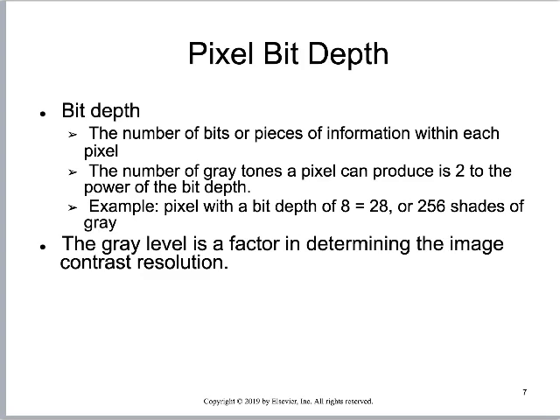Now the way that ties into what we're doing as X-ray techs is related to the fact that we have the power to see through things. So when I look at things as an X-ray tech, I'm not just seeing what's on the surface. I'm seeing past the surface to the bony anatomy, the soft tissue anatomy, and then the opposite surface as well. The backside of the bony anatomy, the backside of the tissue, right? I'm seeing everything superimposed across the area of imaging.